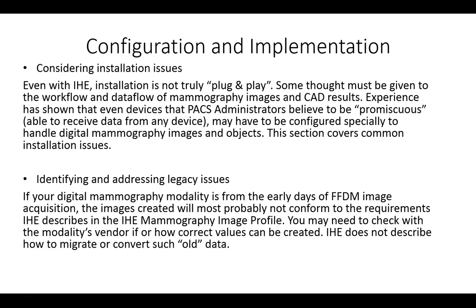Identifying and addressing legacy issues. If your digital mammo modality is from the early days of full-field digital mammo image acquisition, the images created will most probably not conform to the requirements described in the IHE Mammo image profile. You may need to check with the modality's vendor if or how correct values can be created. IHE does not describe how to migrate or convert such old data. It just doesn't even go down there.